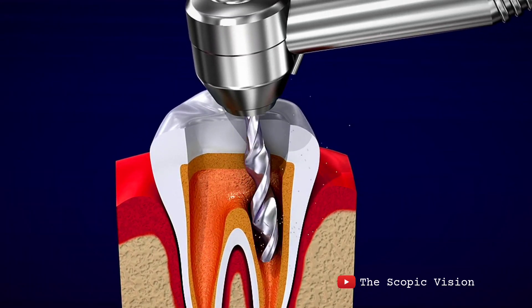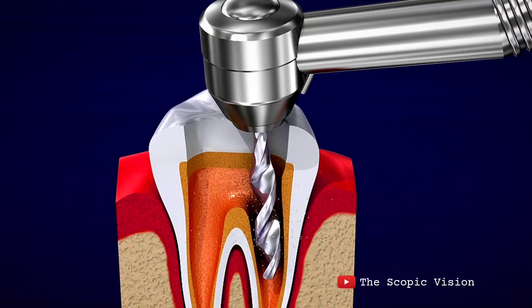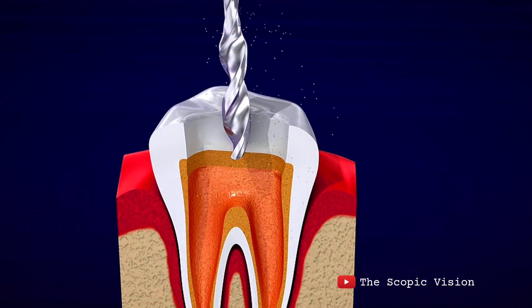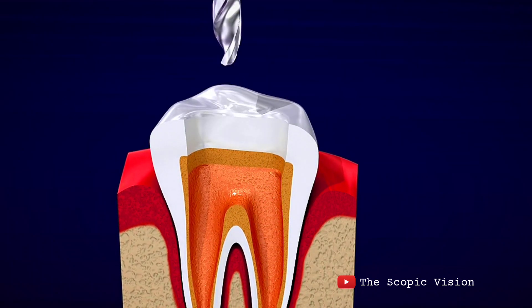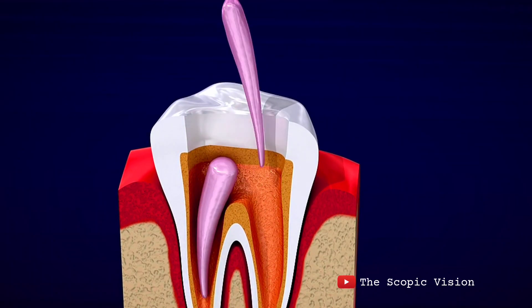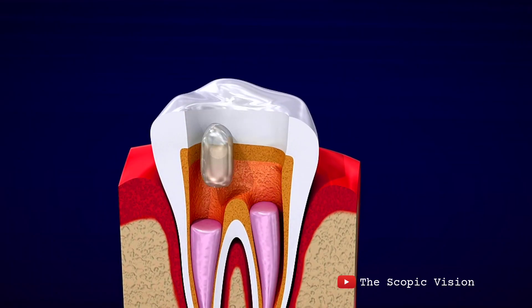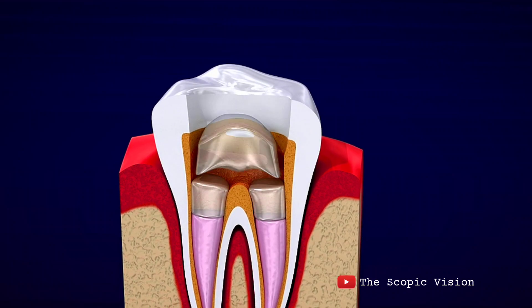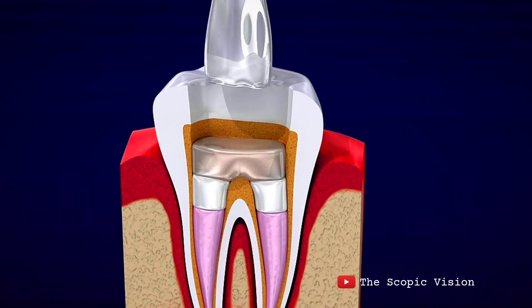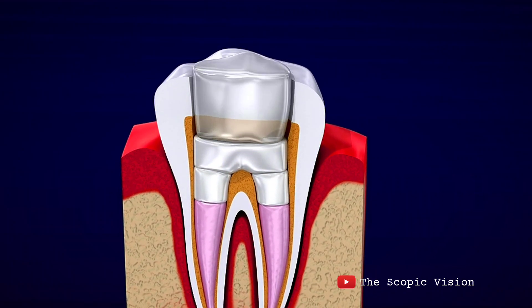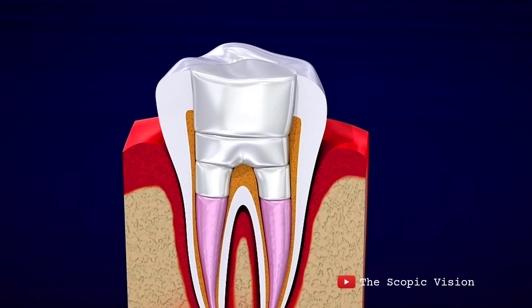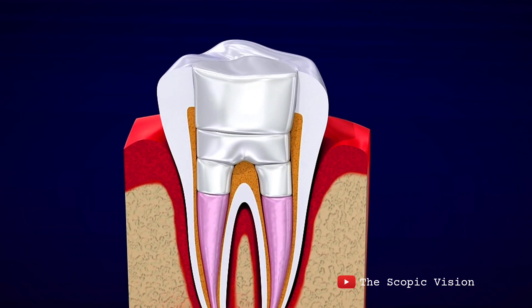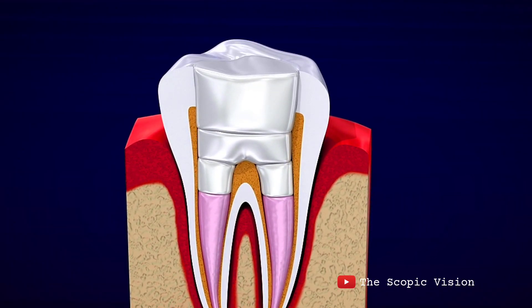After cleaning and disinfecting the root canals and pulp chamber, the empty space is filled with gutta percha, a flexible material, and sealed with a temporary filling. Finally, a dental crown is placed on the tooth to protect it and restore its function.